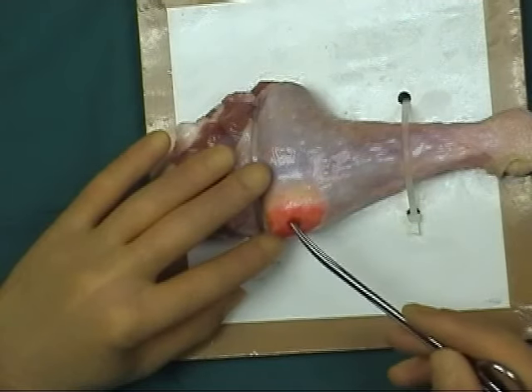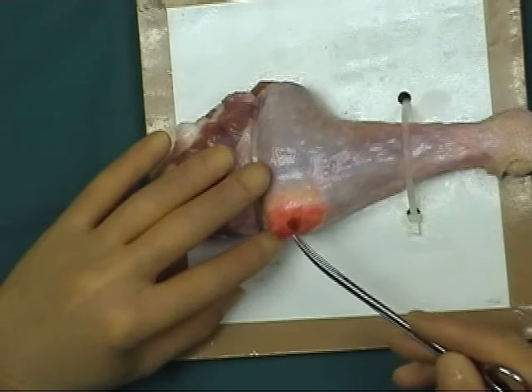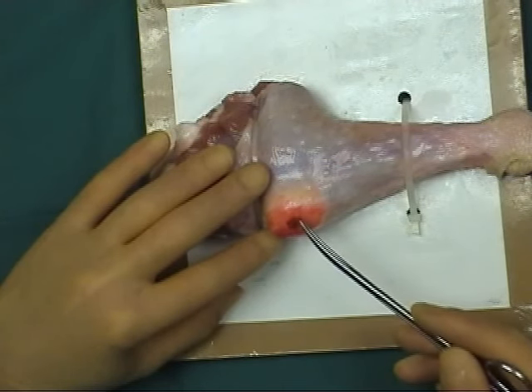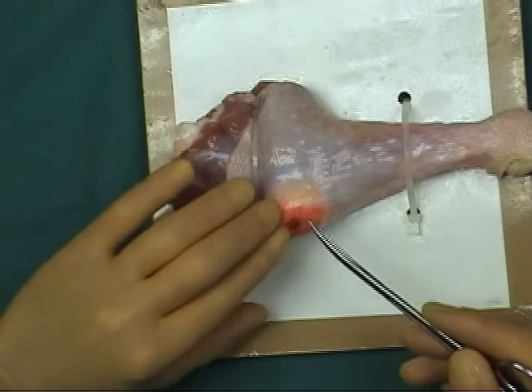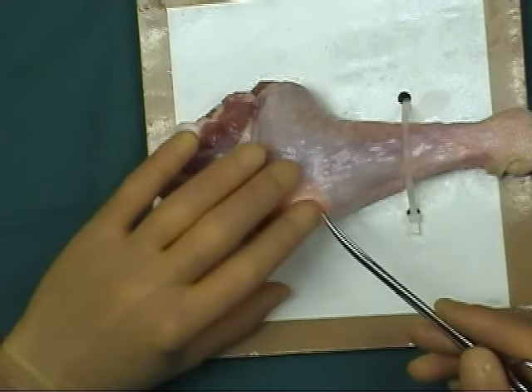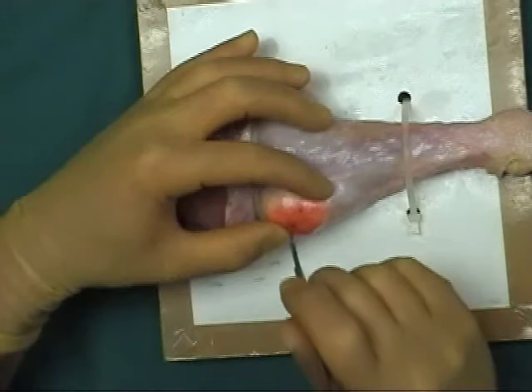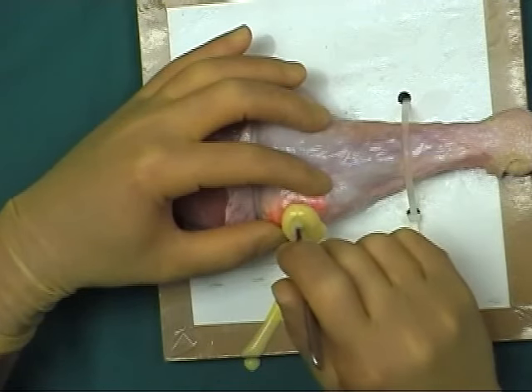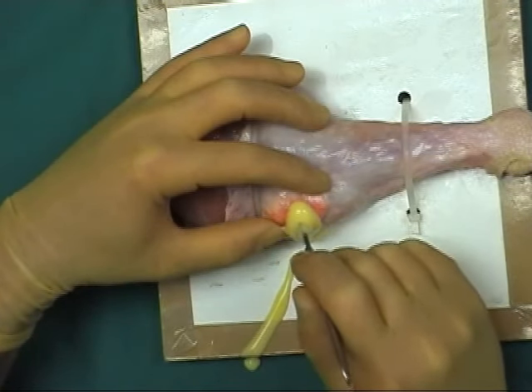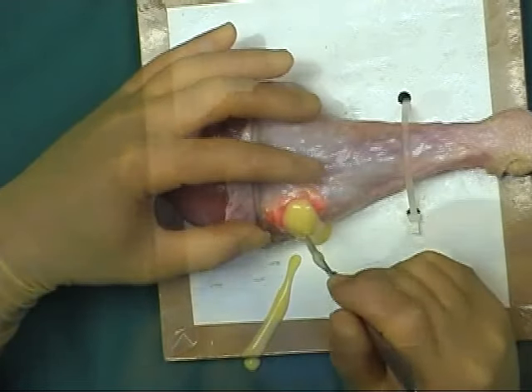In the abscess formed in this specimen, there is overlying skin erythema and a central area of thin and necrotic skin tissue. The area is gently palpated to find the maximum point of fluctuation. The first step is to make a generous incision at this point. This will result in an immediate release of pus, which should be cleared away using swabs.